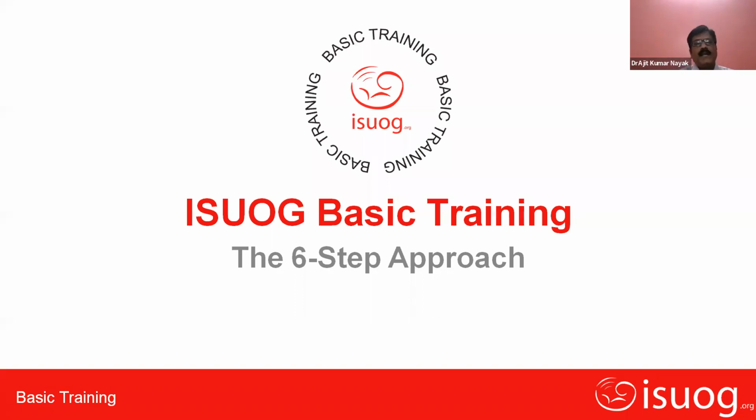So today's topic is the 6-step approach, and as told by Dr. Ashok Khurana sir, the International Society of Ultrasound in Obstetrics and Gynecology recommends certain principles and we have to follow them. We cannot blindly do the survey scan, and we cannot comment on different parameters of the fetus like the lie, presentation, number of the fetus, cardiac activity, and the fetal environment, which includes the placental localization and placental position.